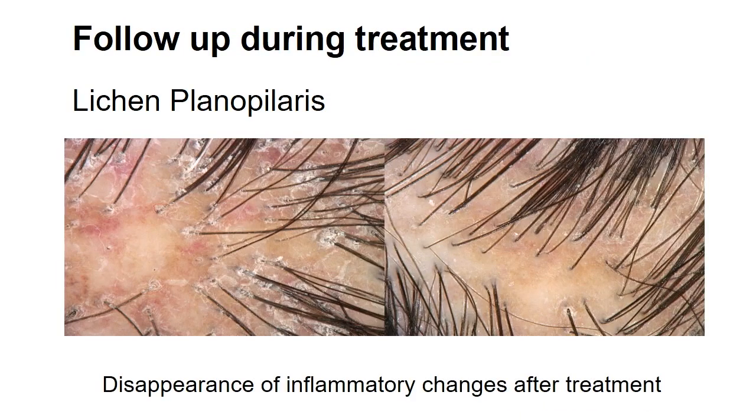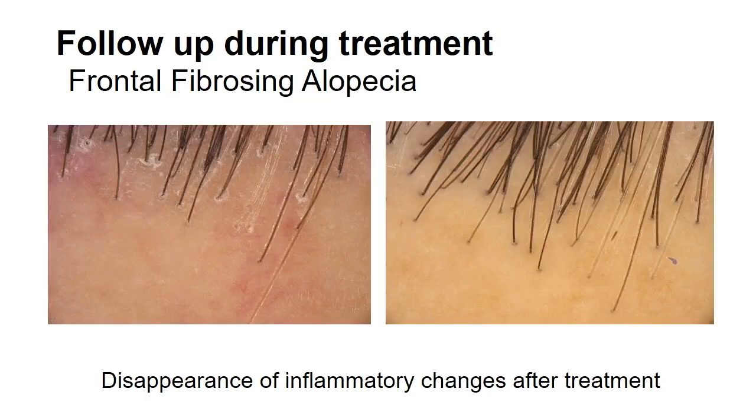And follow up during treatment. Look with dermoscopy, you can see here the peripilar casts are not there anymore, meaning that the treatment is effective. And the same in this case. So it's very useful for that.